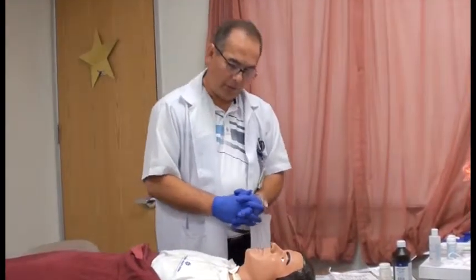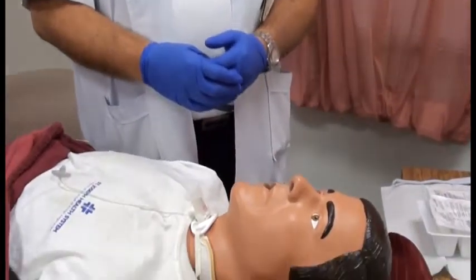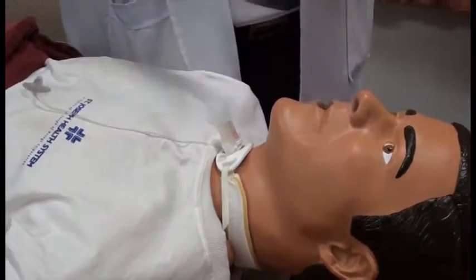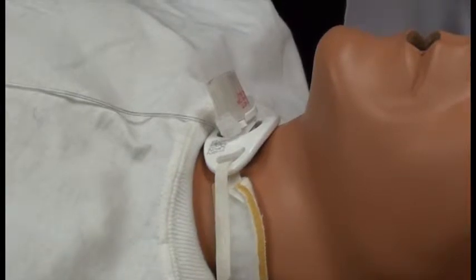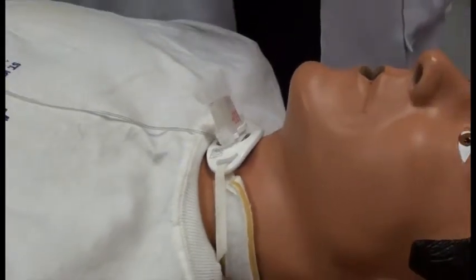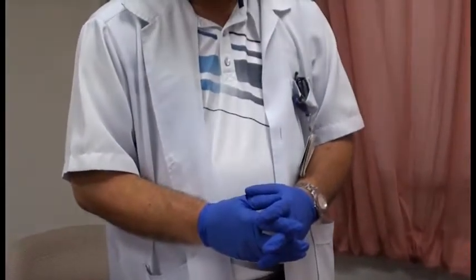So first we're going to assess the patient, also making sure what type of tracheostomy they have. It's either a metal type trach or the plastic type. In this case, this is a Shiley, or they can have the Portex. And sometimes it can just be a stoma. That is, they just have an opening there, and they generally put a tracheostomy in during the nighttime when the patient's asleep, and during the daytime the stoma is open. In that case we're just cleaning the stoma site with saline and making sure there's no buildup of mucus or phlegm.